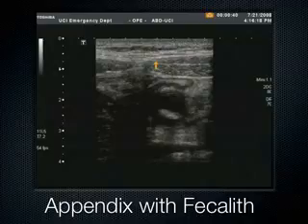That does frighten me, but compressing an appendix, I don't think there's enough extrinsic pressure that you could perforate it. I think the true perforation comes from the inside, getting ready to make it pop. We're pushing a lot of pressure, and maybe I oversold that. We're not pushing so hard that we're causing a very local part of it to perforate. We're pushing just enough to get the muscle bellies to come together.